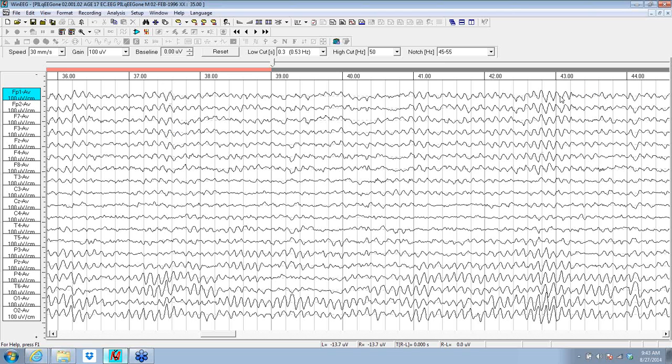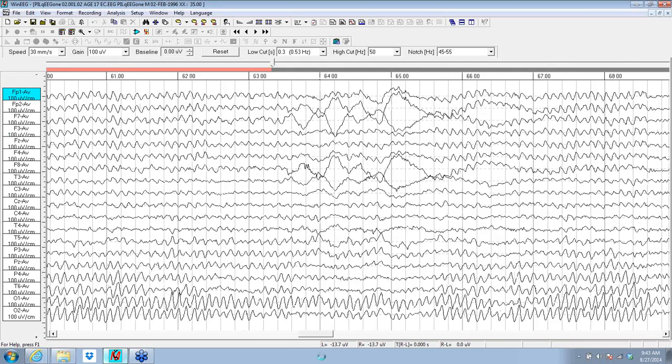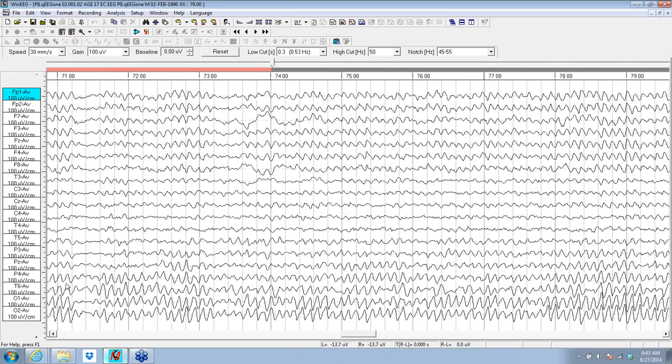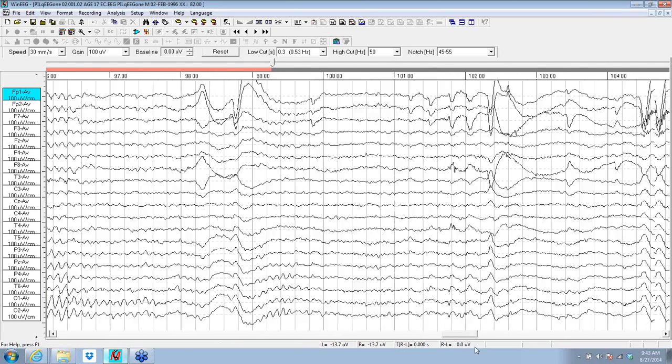The other thing that you should be able to see is that in the back of the head, the alpha doesn't always line up. Sometimes the peaks line up and sometimes they don't. But up front, every time you see this alpha, all these peaks are in line. So the stability of the phase up front is high, and that's going to give us a hypercoherence. And that usually means an affective regulatory issue. Now, the T6 area, cortically, is a little spot at the temporal-parietal junction.